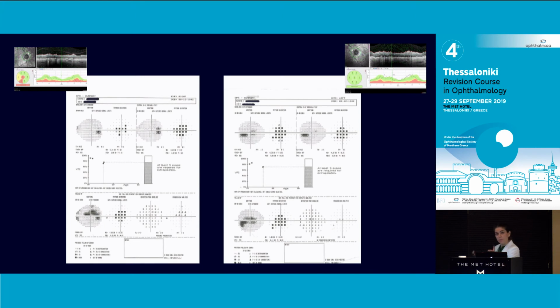But one of the things that's important, I want to say with the visual field, when you do the visual field test, there is a little cross, and there's a little target above that, yeah? And you must tell your patient initially, please look at the cross, because that's how the machine detects the blind spot. And then the patient is supposed to lift the gaze at the spot to do the field.